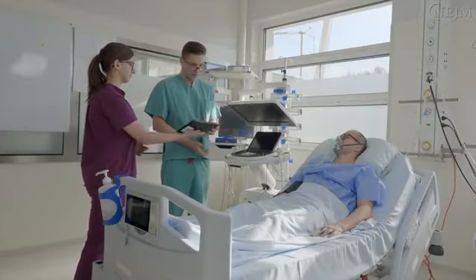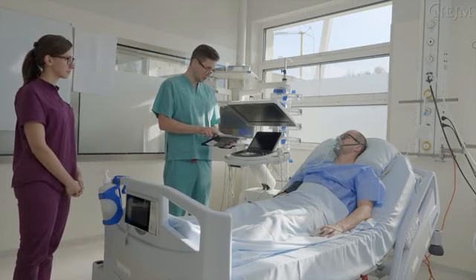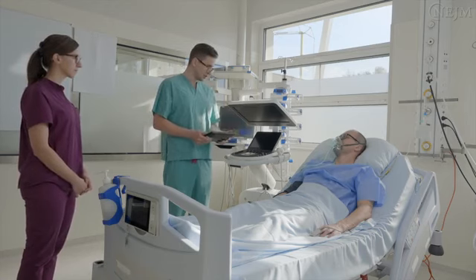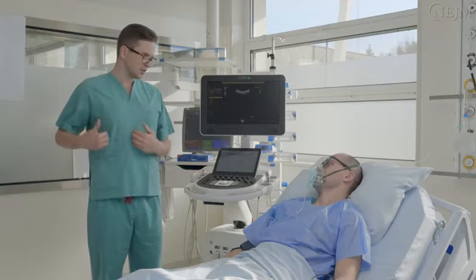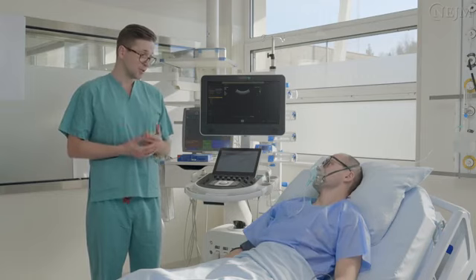Before you perform the examination, introduce yourself to the patient and verify the patient's identity. Maintain comfortable thermal conditions during the examination by covering the patient or providing a comfortable room temperature. Place the patient in a semi-recumbent, supine, or prone position. If the patient is able to follow instructions, the examination may be performed with the patient seated upright.